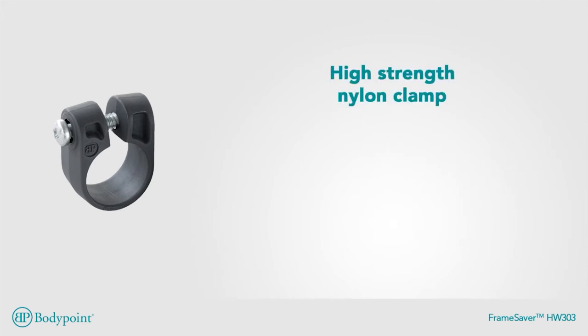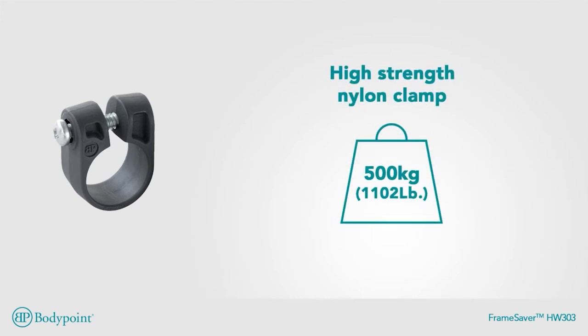This high-strength nylon clamp can support 500 kilograms without breaking.